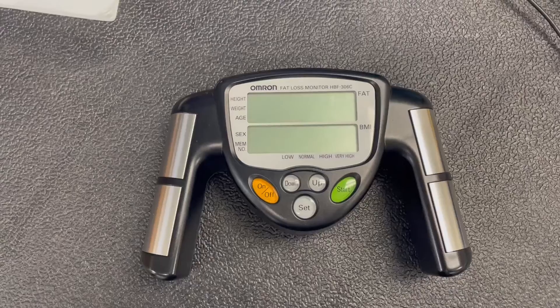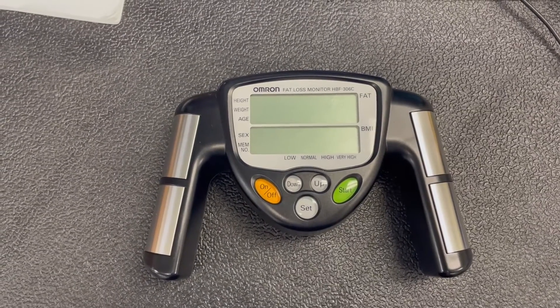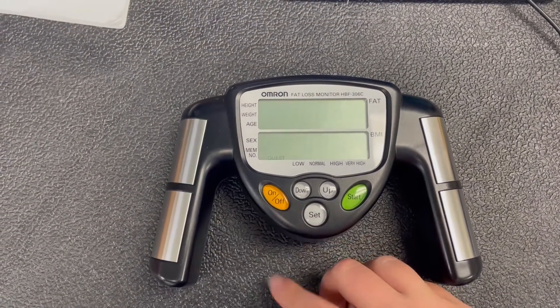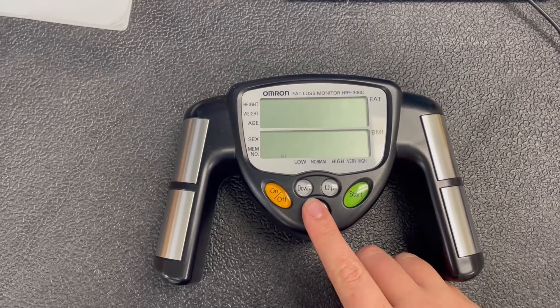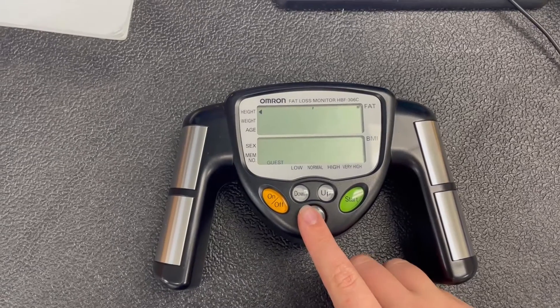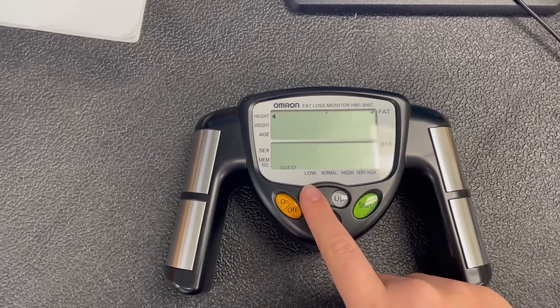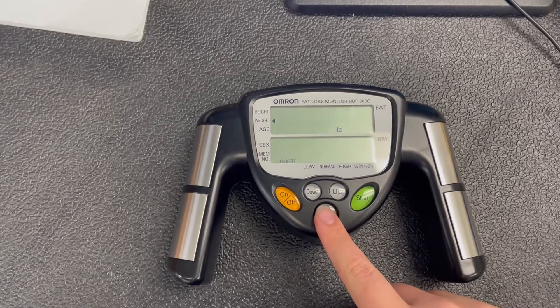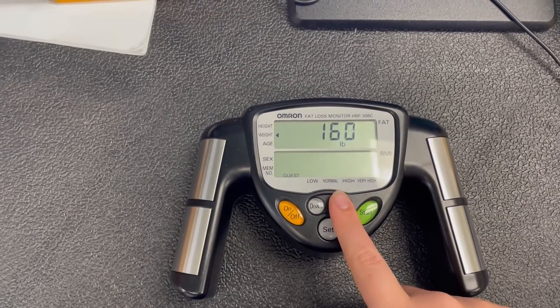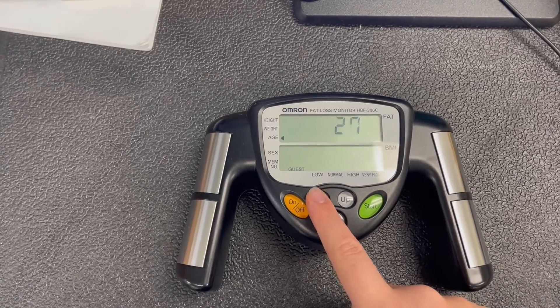Another way to measure body composition is by using the handheld monitor. To calibrate the monitor, do the following steps: first, turn it on. We're going to keep the setting as guest; you can also select normal. Then, based on your subject's height and weight, enter it using the up and down buttons. Use the same buttons to determine age.